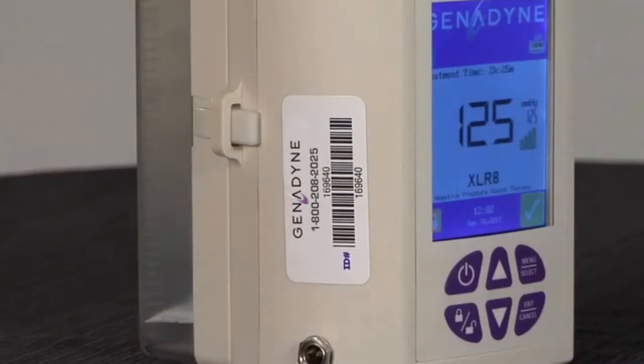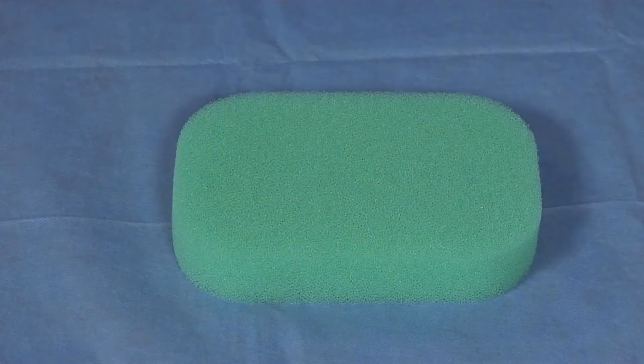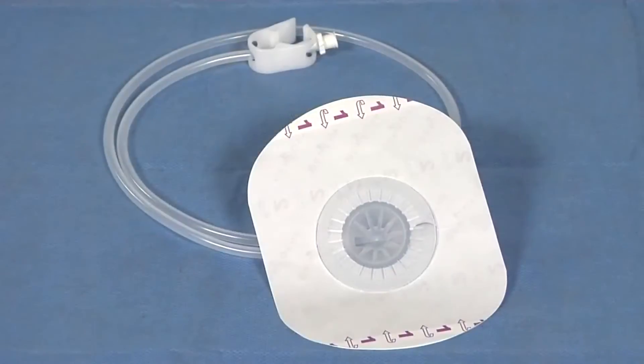The Genodyne Asset Tag is important and must remain on the unit in order to track the device as part of the compliance process. The Genodyne 800 number is clearly visible on the Asset Tag should it be necessary to call for an in-service or support. The Genodyne wound dressing kits come complete with the following: a specific size of green foam, transparent films, and a port dressing.